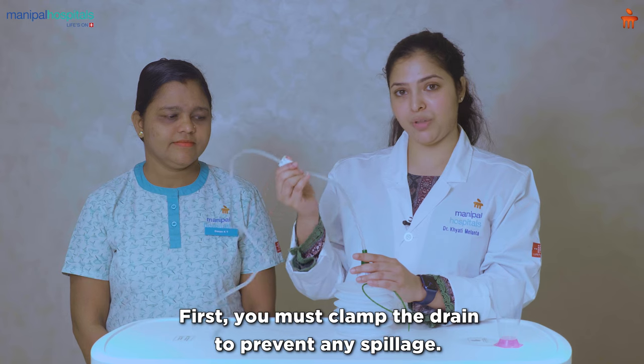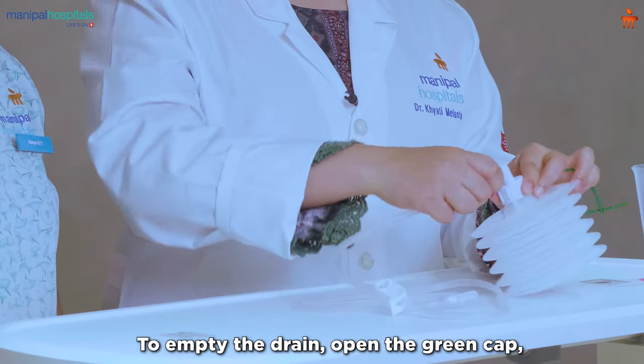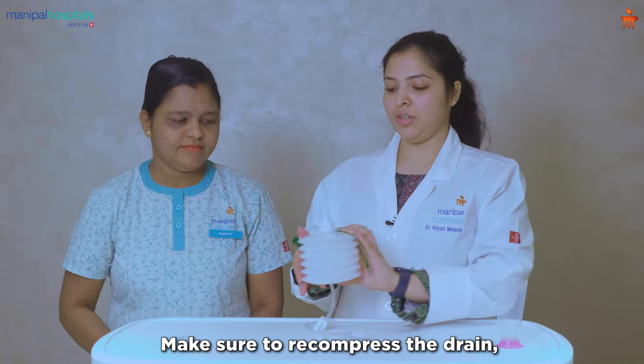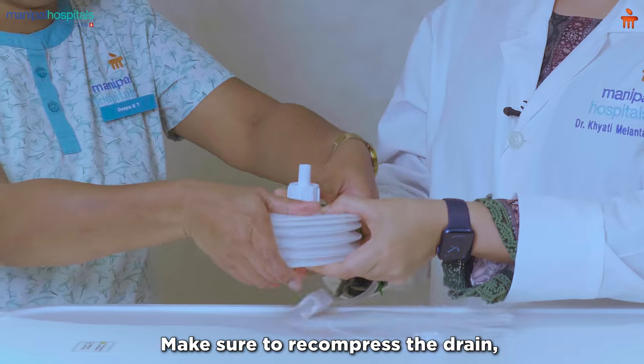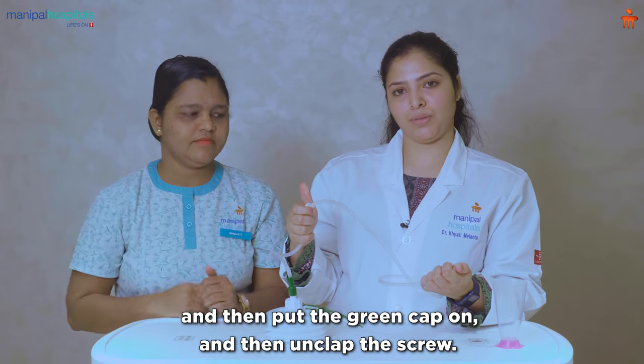First, you must clamp the drain to prevent any spillage. To empty the drain, open the green cap and empty the contents out into the measuring jar. Make sure to recompress the drain, then put the green cap on, and then unclamp the drain.